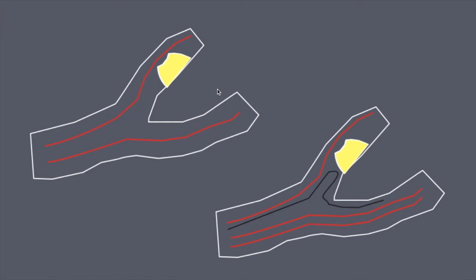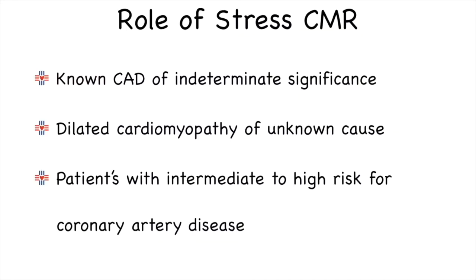During a physical activity session or during any form of stress where there is increased myocardial blood flow, the vessel which has significant coronary artery disease is unable to cope with this increased demand. Compared to the normal myocardium, the myocardium supplied by the diseased vessel will have hypoperfusion. This forms the basis of ischemia testing in patients with coronary artery disease.